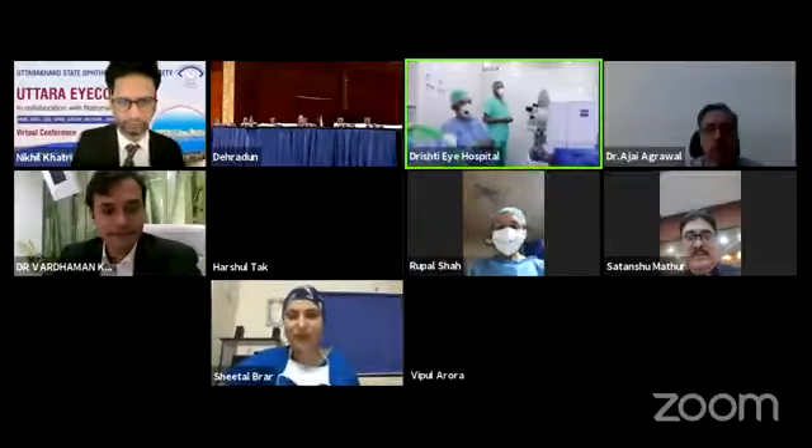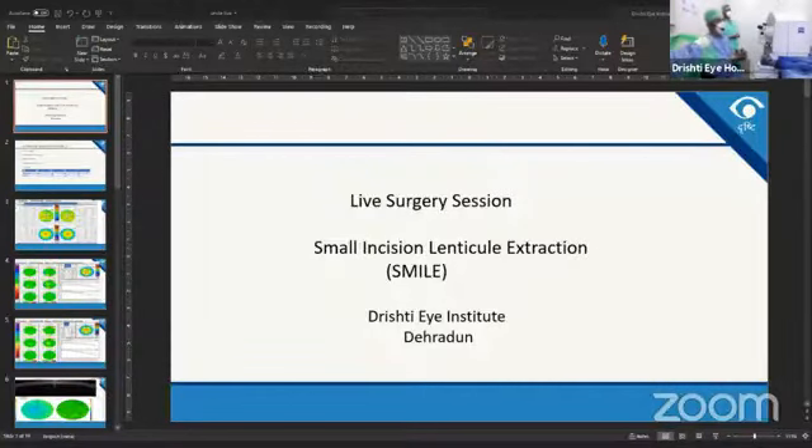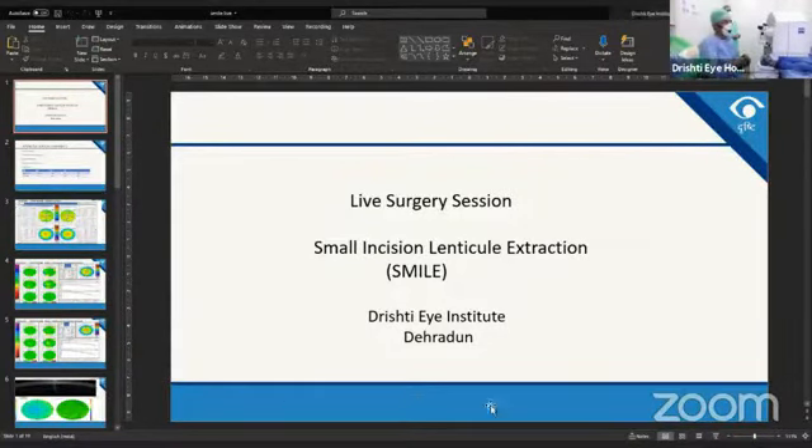We'll be starting with the SMILE webcast. We are planning to do SMILE. Dr. Amrita, if you can show us the patient's data, that'll be nice. I can see Dr. Niven here. We welcome Niven here.